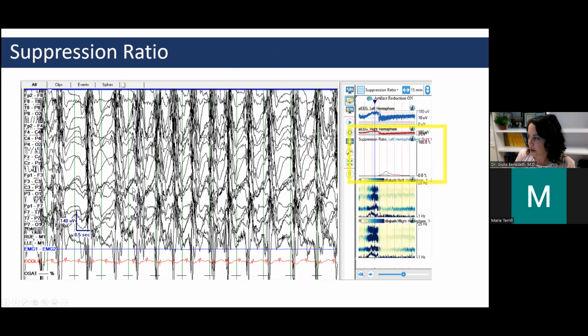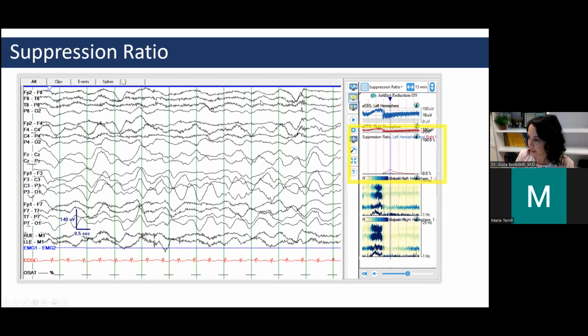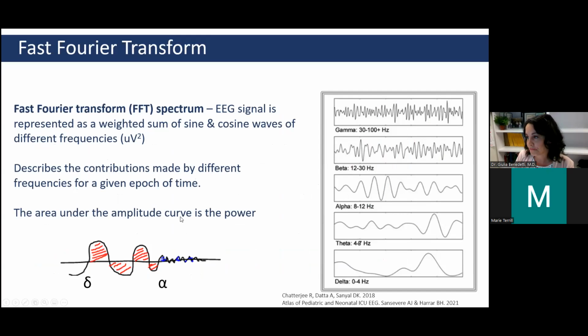During a seizure, there's no suppression going on, so your suppression ratio is 0, but sometimes post-ictally, you get post-ictal suppression, and that can be greater over the hemisphere that was seizing. And so in this right-sided seizure example, the suppression is greater over the right hemisphere, so that's just another tool to help you localize where things were happening.